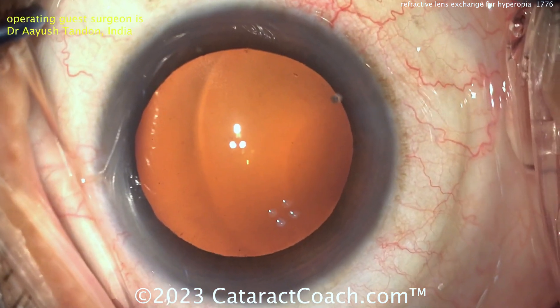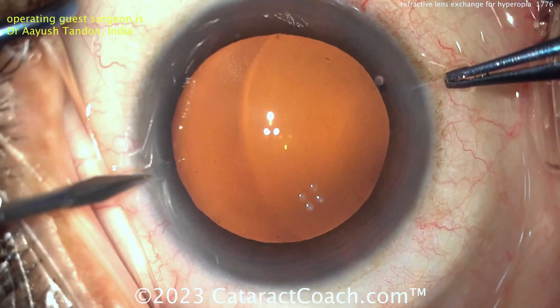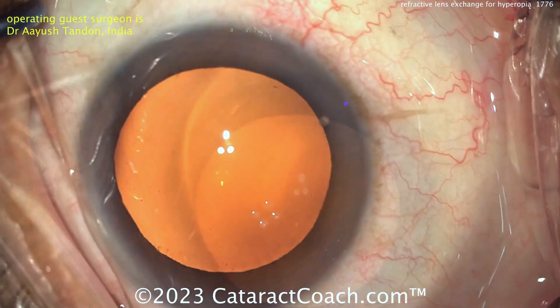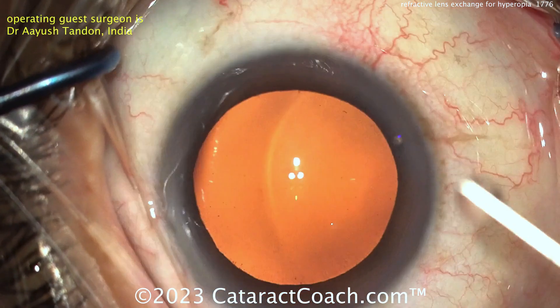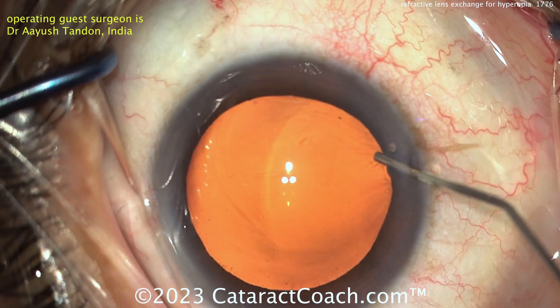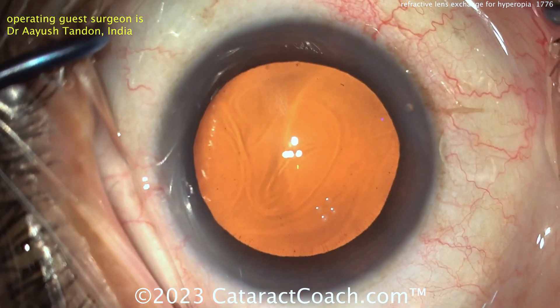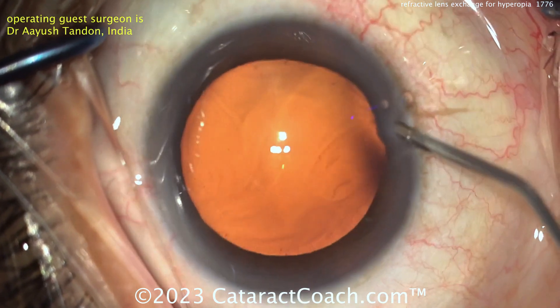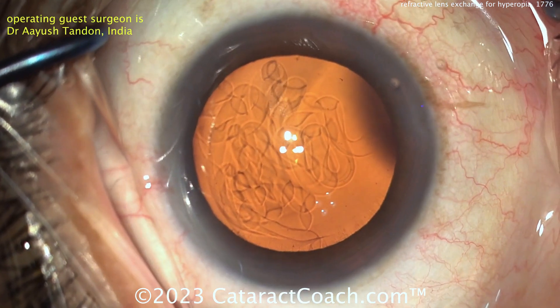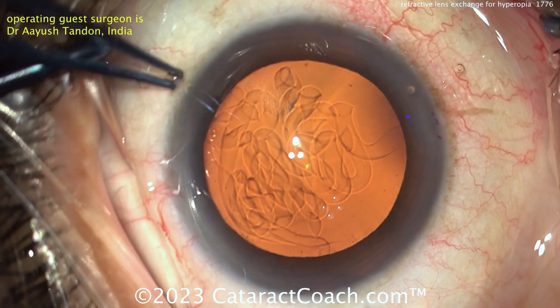You can see beautiful dilation, really not much cataract changes at all — that's pretty typical for refractive lens exchange. The beauty is we're able to correct all this without trying to steepen that cornea. I've never been a big fan of LASIK for high hyperopia; it's just too much steepening required. My LASIK limit is probably around plus 2 diopters for hyperopic LASIK. Other than that, you really want to do an IOL-based surgery, especially if the patient's already presbyopic — if the patient's 60 years old it kind of doesn't make sense to LASIK.